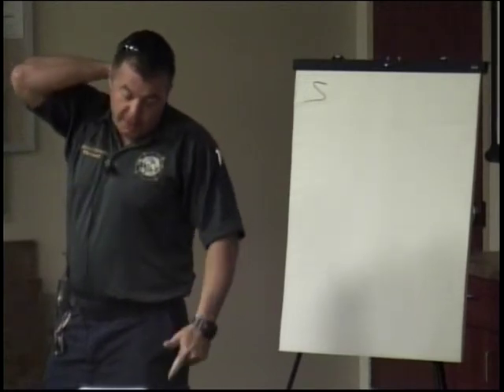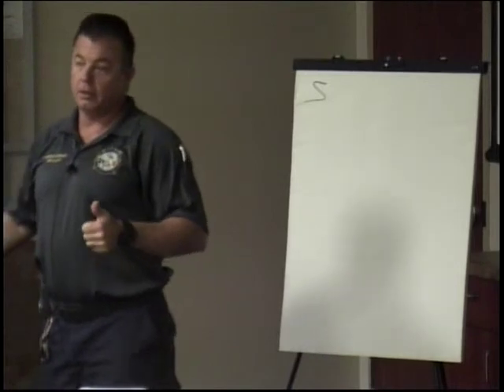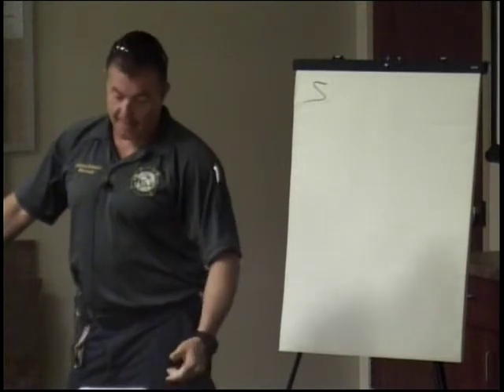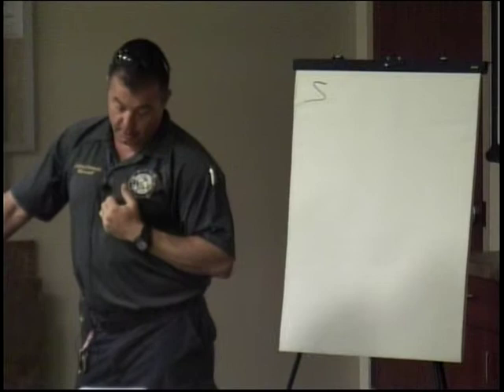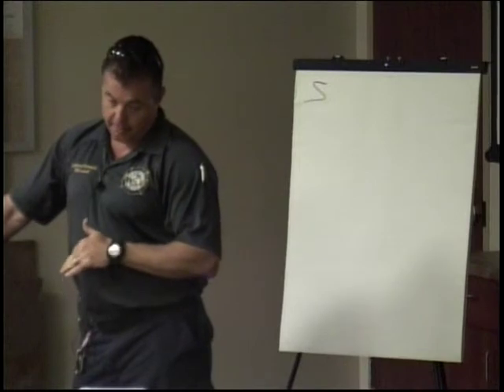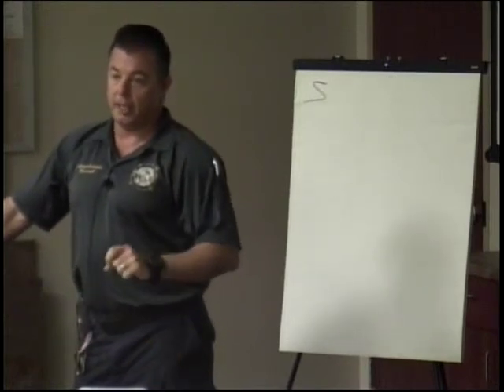Hyperventilation and hypoventilation. What's hyperventilation going to do to your CO2 number? Did I hear decrease? Yeah. Anxiety, bronchospasms, embolus, decreased cardiac output, hypotensive patient, pulmonary edema, all that stuff can drop your CO2 number.